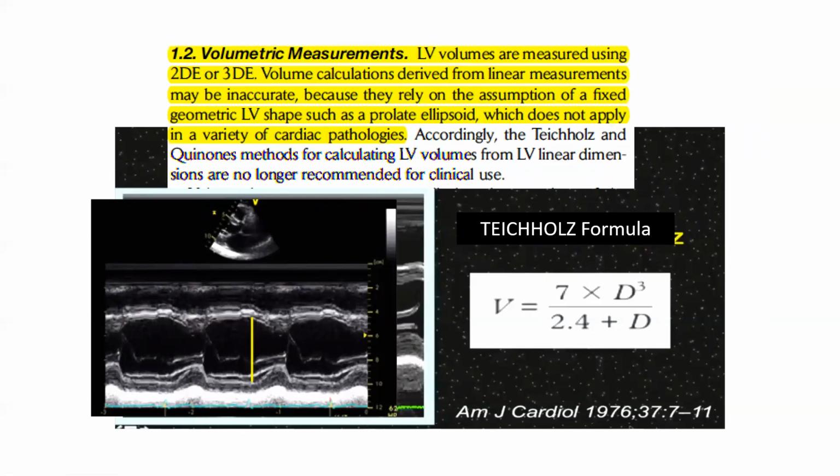In general, the left ventricular diastolic volume is related to the cube of the left ventricular end diastolic dimension. So if your left ventricular end diastolic dimension is 5 centimeters, your left ventricular end diastolic volume is roughly 125 cc's. And this applies in normally shaped ventricles. Again, we're not recommending this technique for routine clinical use, but those of you who like thinking about left ventricular geometry will find that a useful fact to know.